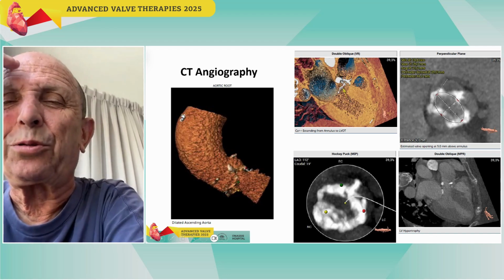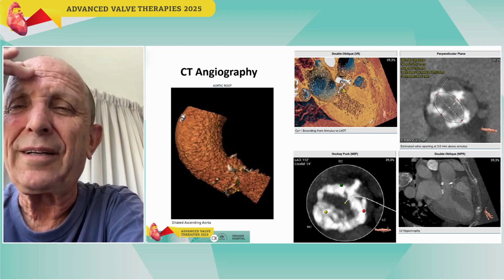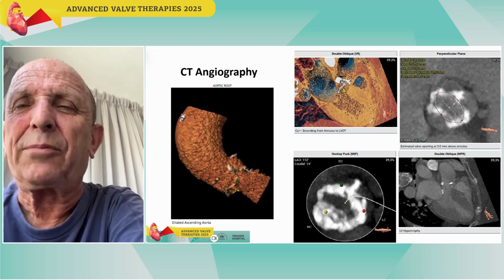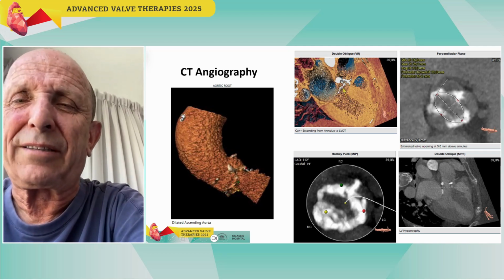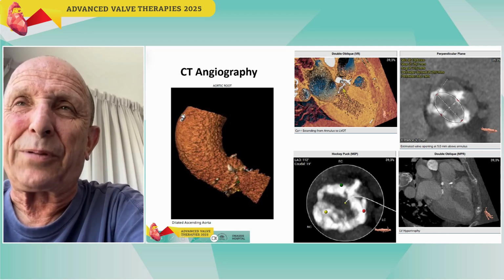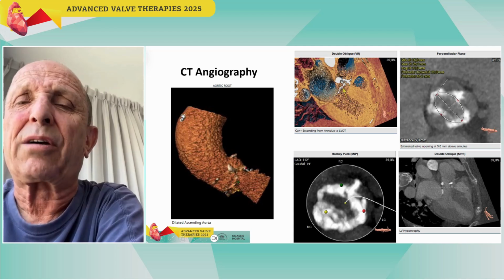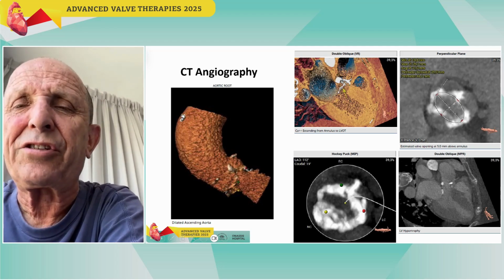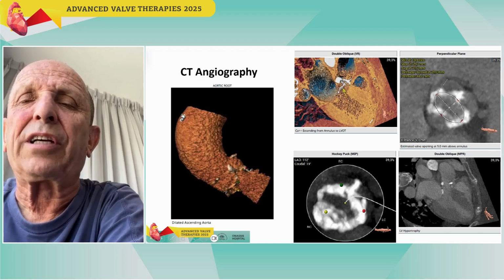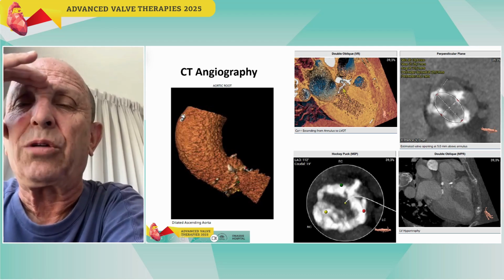Look, George, you know what they call in Medtronic best practice. I'm not going to die of modesty, but we wrote this best practice years ago. According to this best practice, you are supposed to calculate the balloon diameter according to the minimal diameter. This is history, come on. It expands, because it is not a rigid calcium that doesn't move with the balloon.